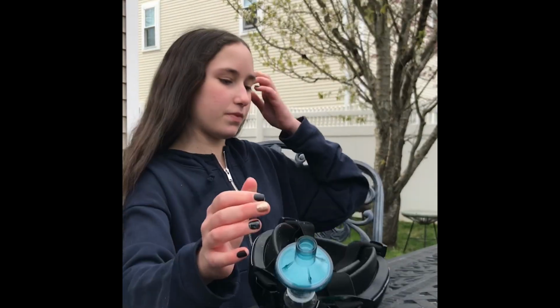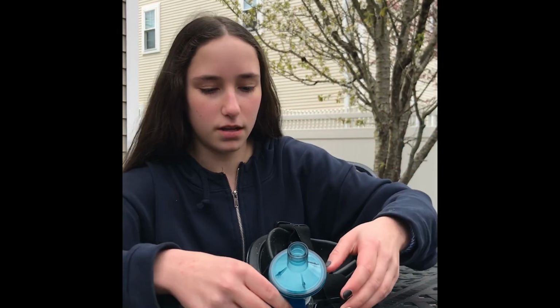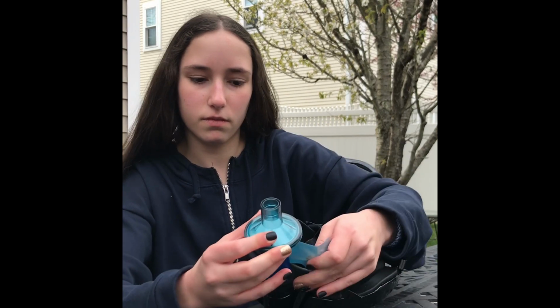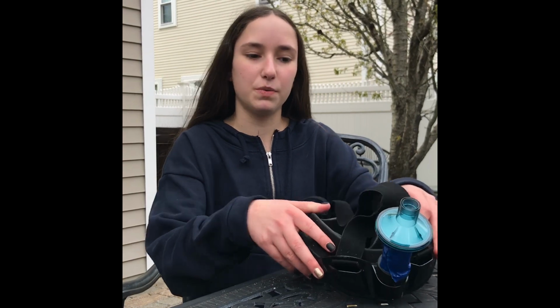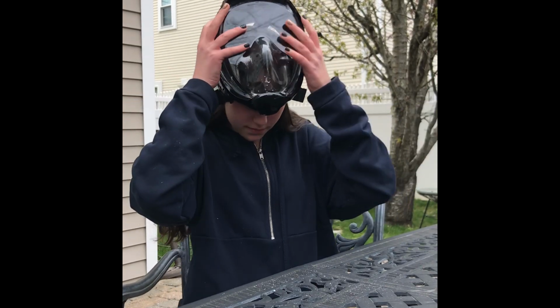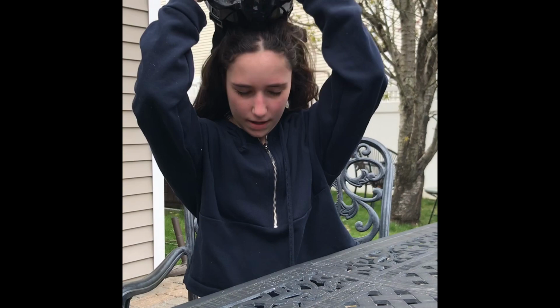Now we're going to take the filter and place it in. To get an airtight seal, we're going to take a piece of duct tape and wrap it around, and just squeeze it to make sure there's nothing. Now we're going to put the mask on and check for a tight seal. To do this, we cover the top and breathe in. If there is a tight seal, when you breathe in, it'll suction to your face.